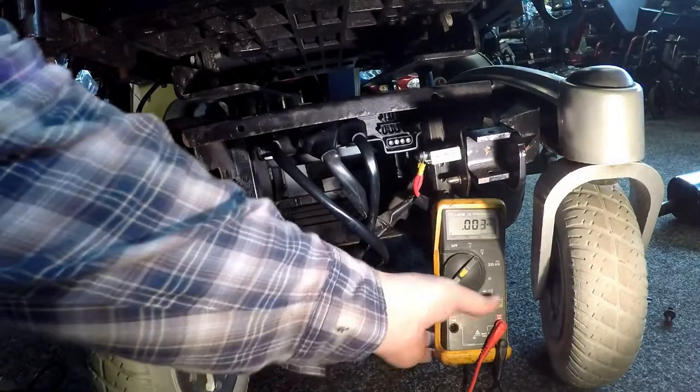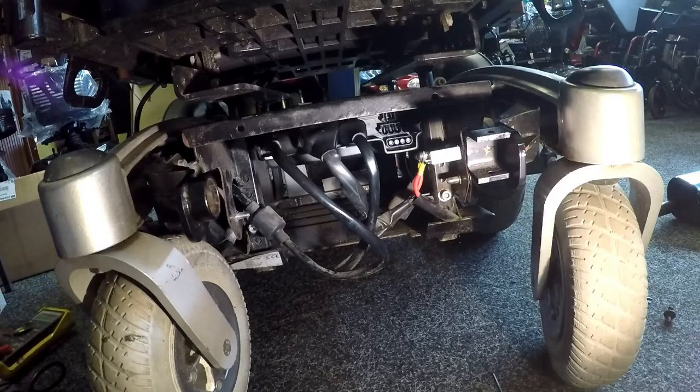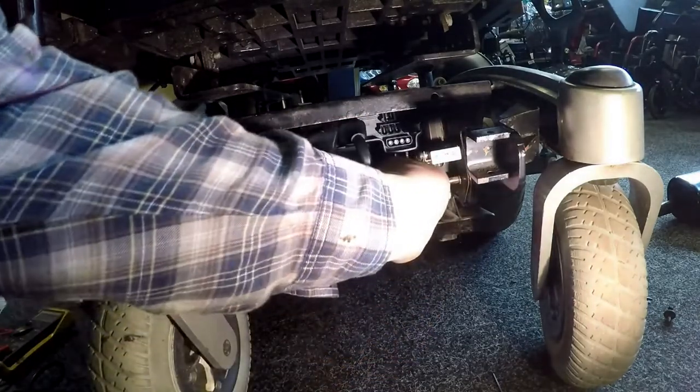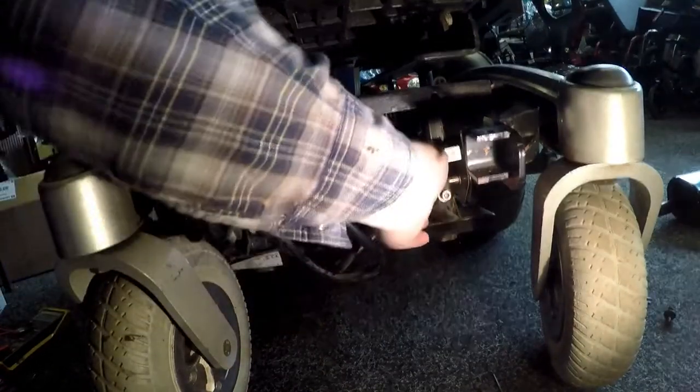Now because we're getting these intermittent faults, when the joystick doesn't switch on we're hitting three volts — there is a problem there. We need to check all the connections; there could be possible corrosion on the connection. These look okay but I still think we should take them off and have a look.